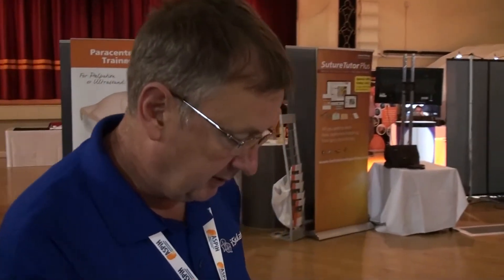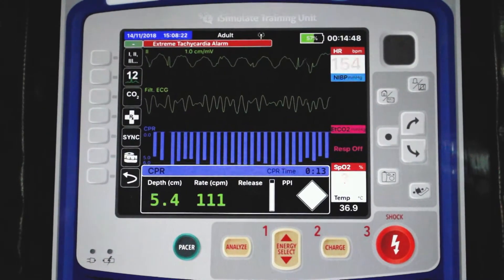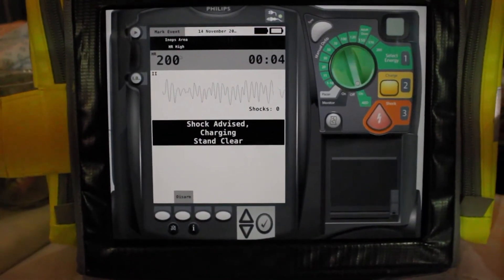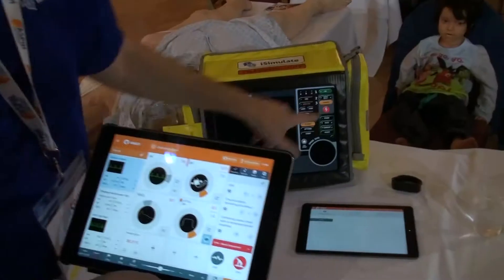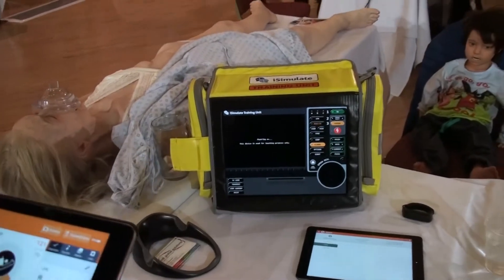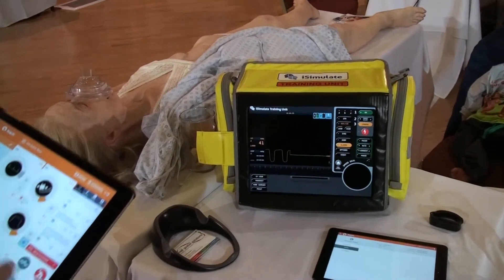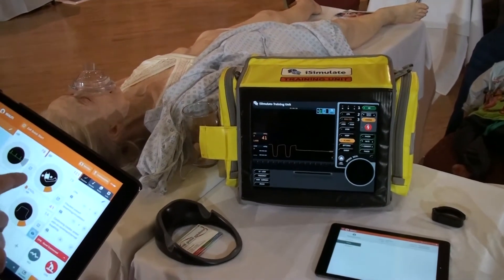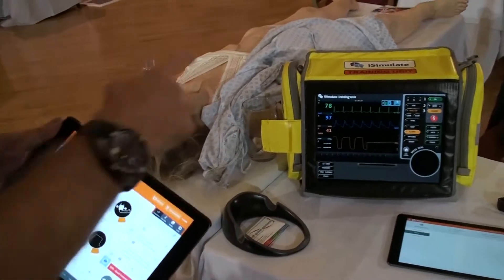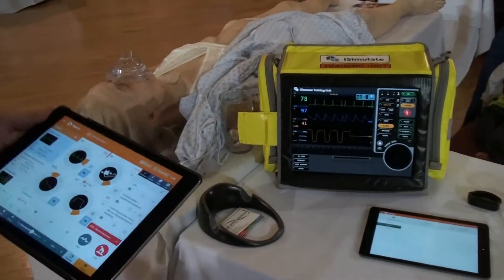If I want to change the monitor interface — let's say you're used to using a LifePack 15 — I'm able to change the monitor screen and we'll now start working on a LifePack 15 rather than a ZAR. I can just add in the vital signs here and give you more and more vital signs and sounds and other things.